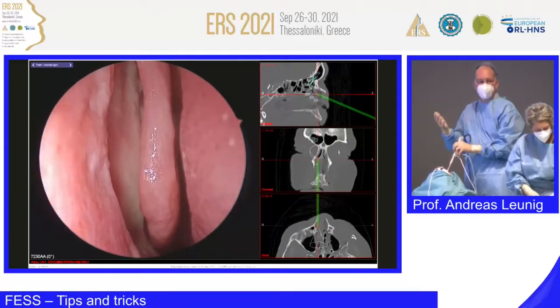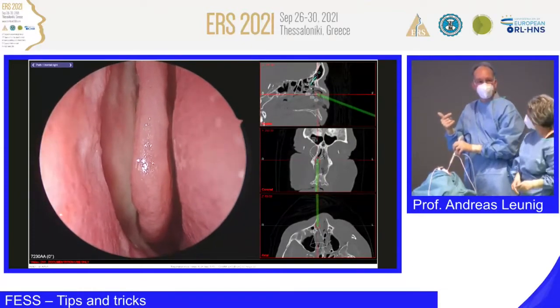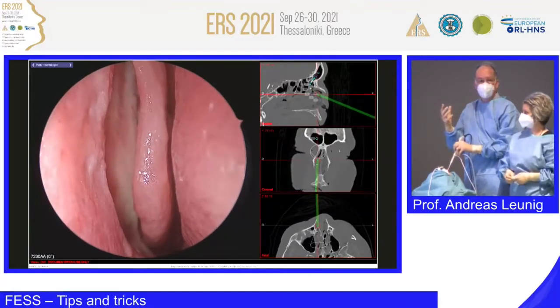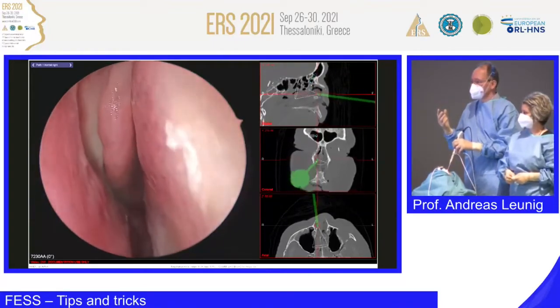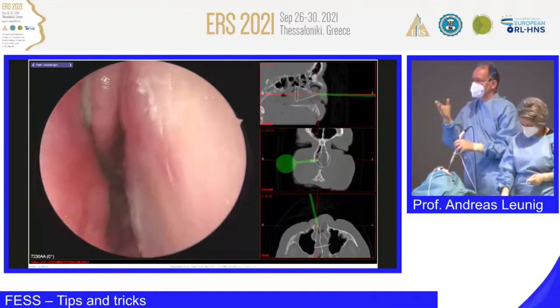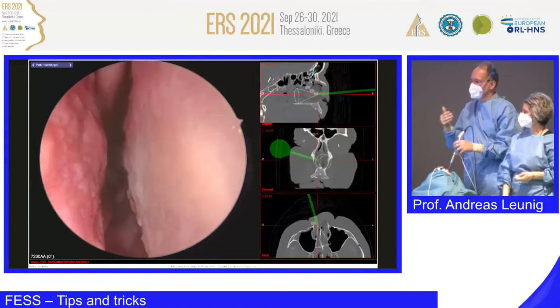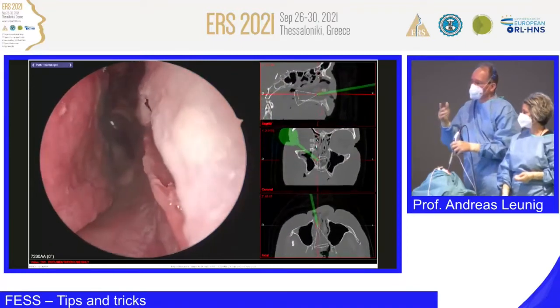And luckily, we don't have any bleeding here, but I always feel it could bleed. I'm serious, so I handle this cadaver like I would do surgery. Now, coming back here to the septum, can you see the difference? I mean, this is a very easy and straightforward procedure, and now it's much better, and it will heal nicely.